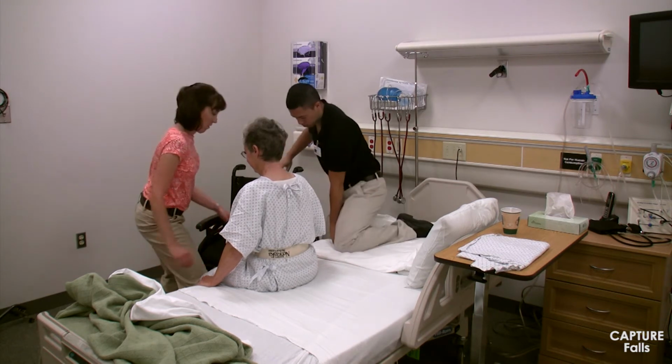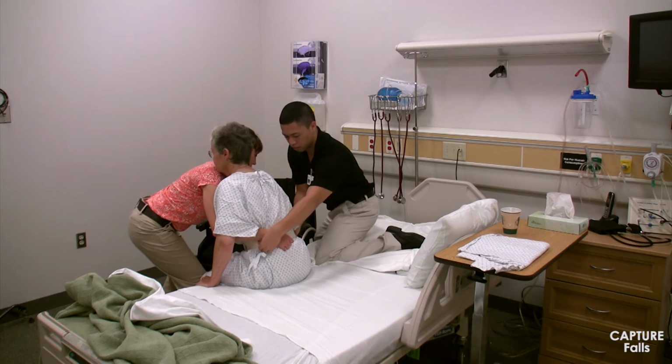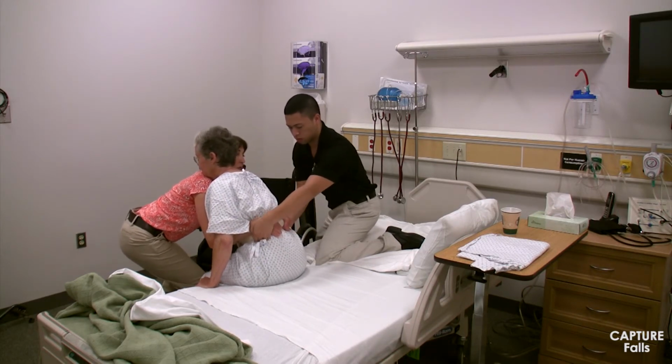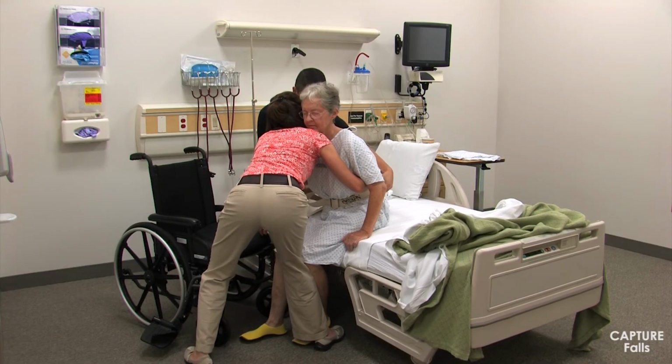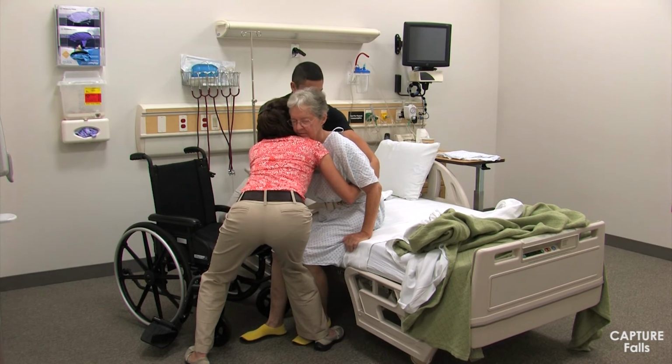He should grab onto the gait belt and lean forward at his hips while maintaining the natural curves of his back. Instruct the patient to lean her trunk forward and to push through her arms and feet to slightly raise her hips off the bed. At the same time, rock your body weight back onto your back leg to use your body weight to assist the patient in unweighting her hips.